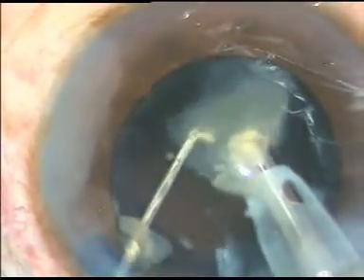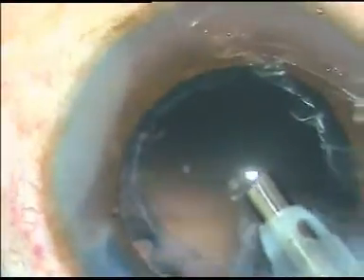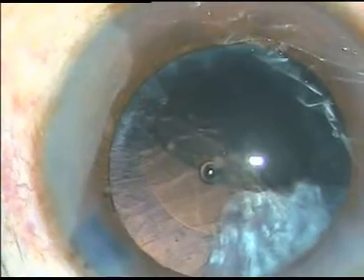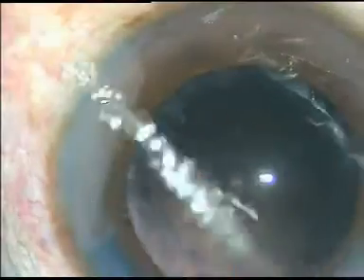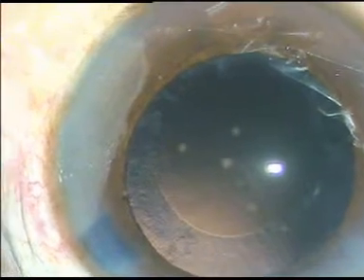So the nucleus is removed and there is no epinucleus in this case. I just have to remove the cortical fibers that is there in this case. Direct Simcoe cannula is again taken and the cortical matter, very soft peripheral fibers of the lens is removed. The undersurface of the anterior capsular rim is polished a bit. There is no cells sticking to the posterior capsule in this case.